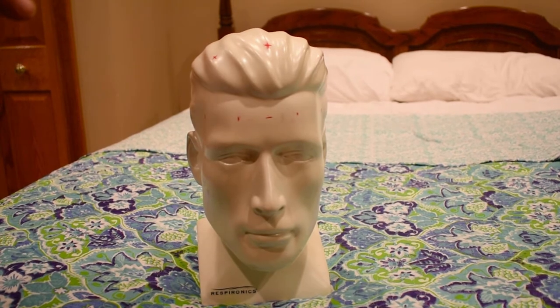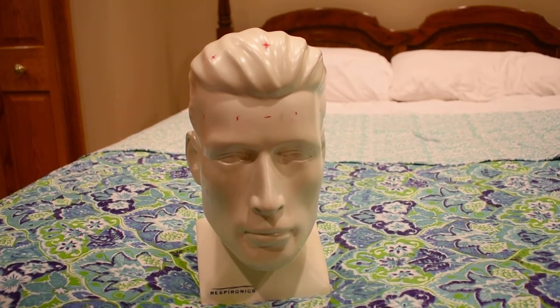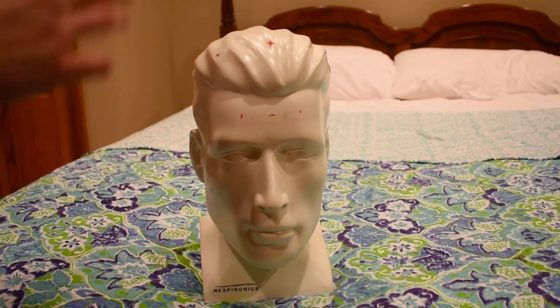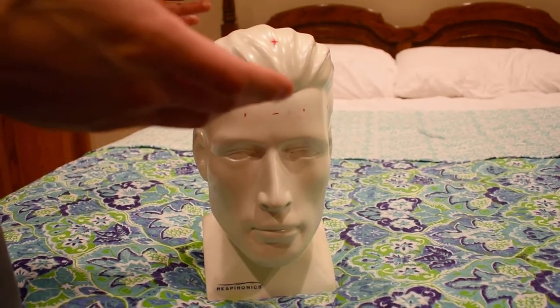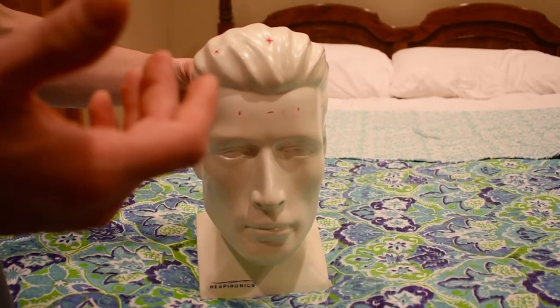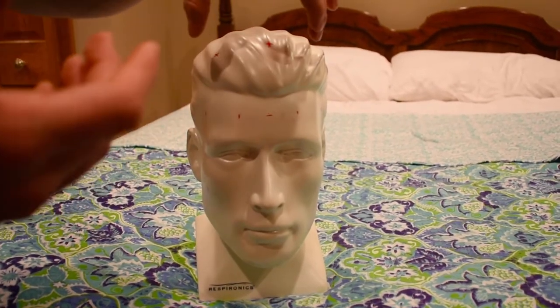I hope that you guys were able to get a better visualization of how this process works to get our 6 exploring electrodes that are utilized for standard polysomnography: our O's, C's, and F's.